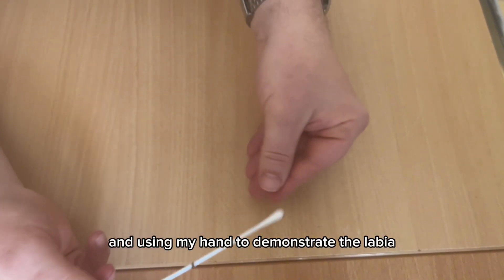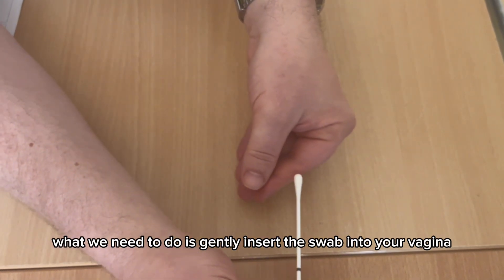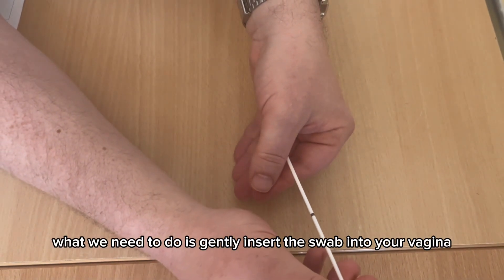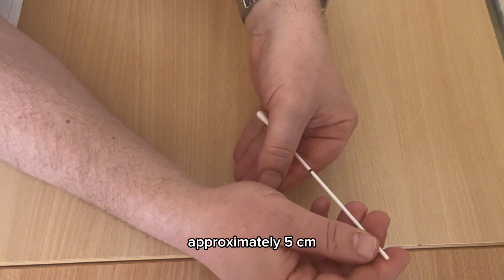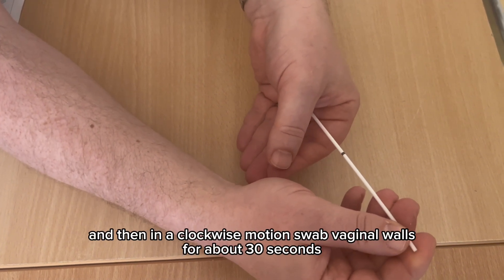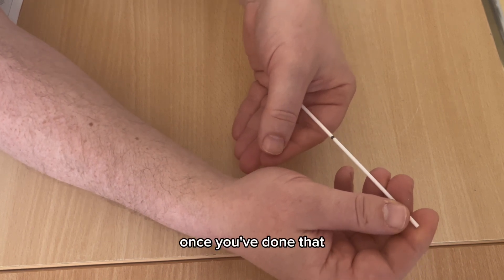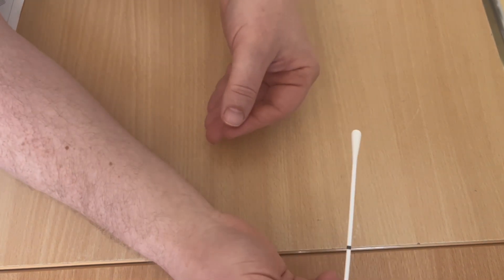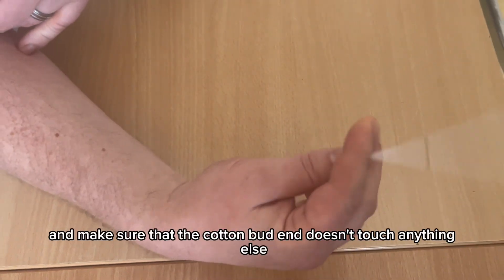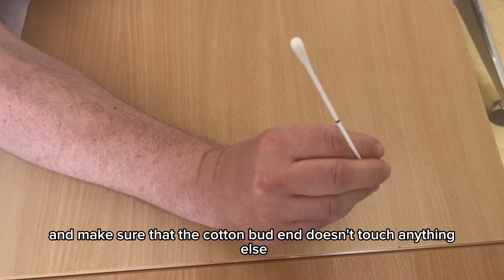Gently insert the swab into your vagina approximately five centimeters, then in a clockwise motion swab the vaginal walls for about 30 seconds. Once done, withdraw the swab from your vagina and make sure the cotton bud end doesn't touch anything else.